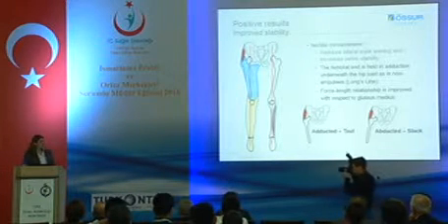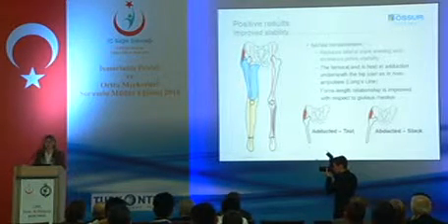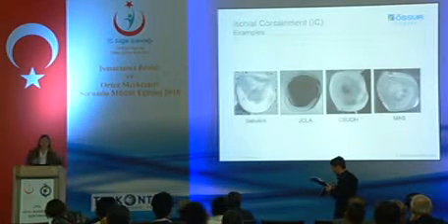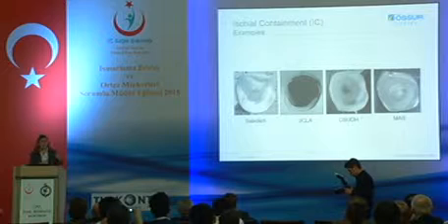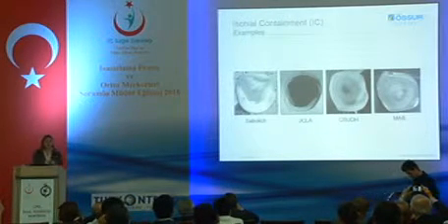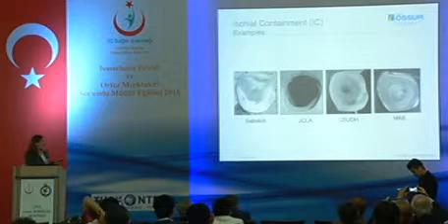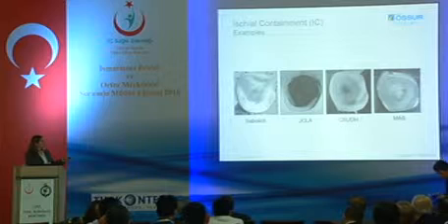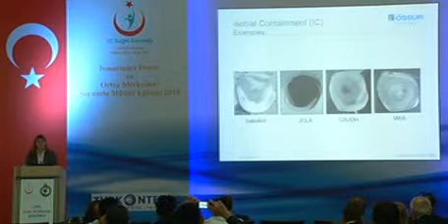So with ischial containment, there's the basic concept, but there's a lot of different types of designs. Throughout the years, many people have looked at it and changed the shape slightly to see how it would work. However, the main thing is that they all contain the ischium in some sort of way.